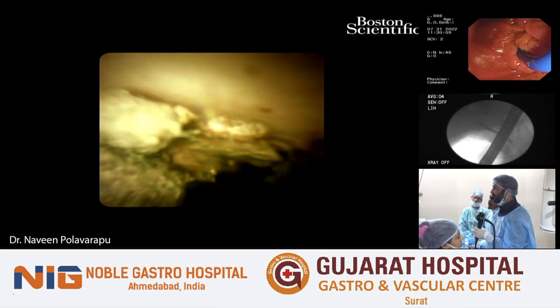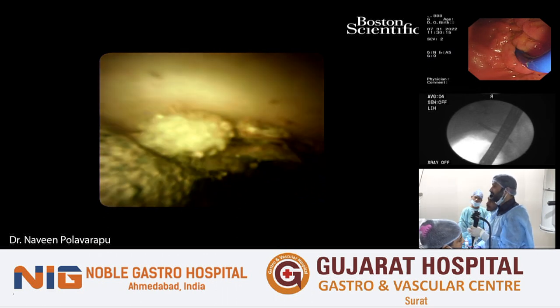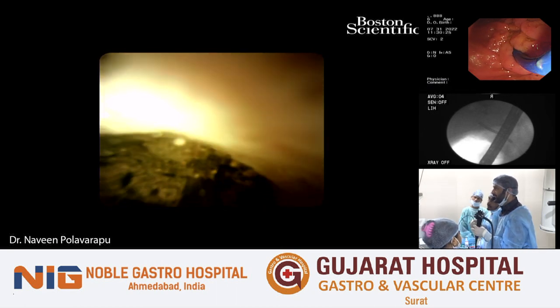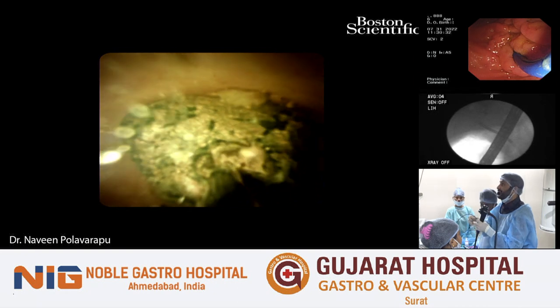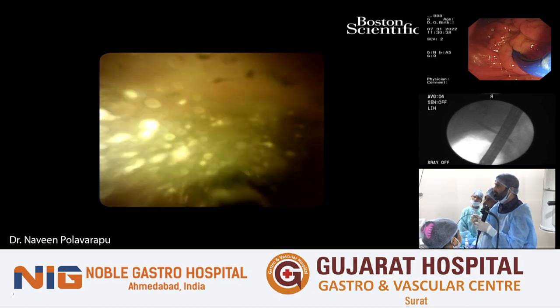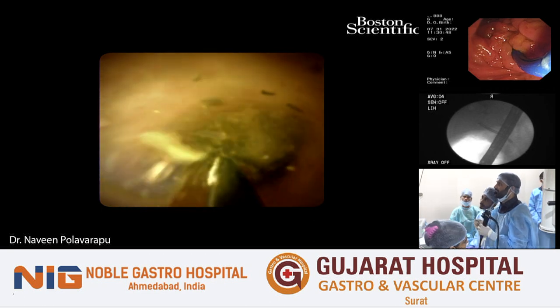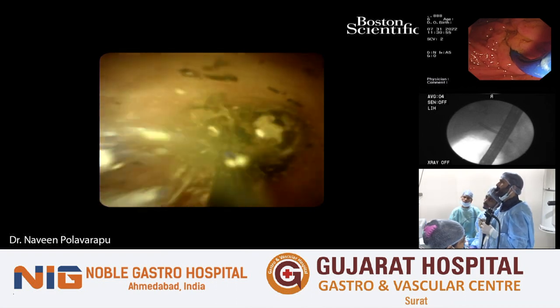When the EHL came into the market, I was in the UK in Liverpool. I was one of the first European centers which did trials on EHL versus laser. We started this in 2007 when the SpyScope legacy was there. I remember the views at the time were just horrible. But as we got into the DS1, the images were much better. We initially started using laser, but afterwards we switched to EHL.